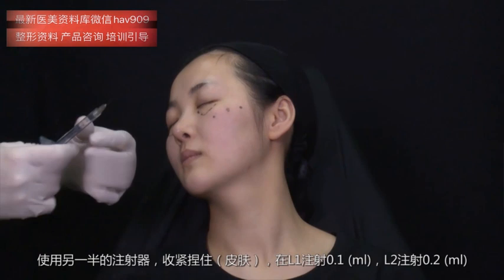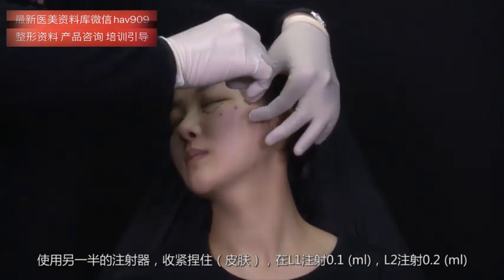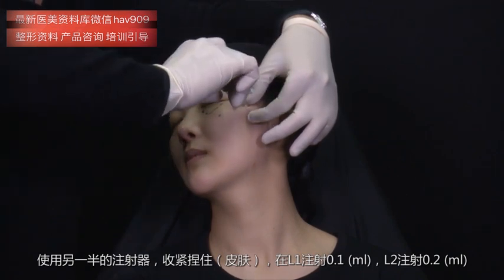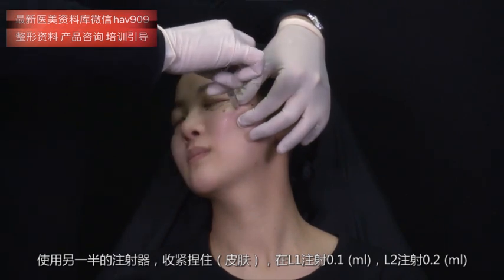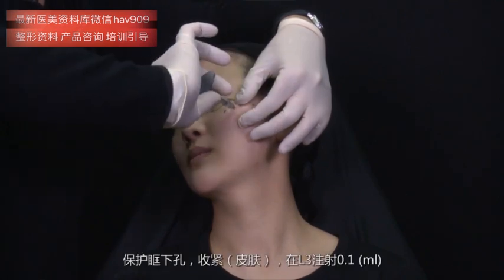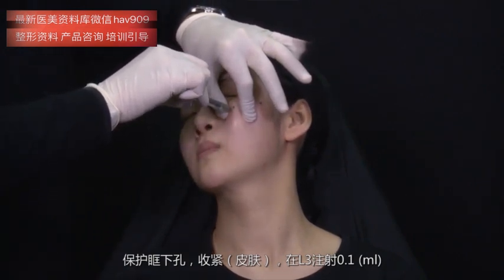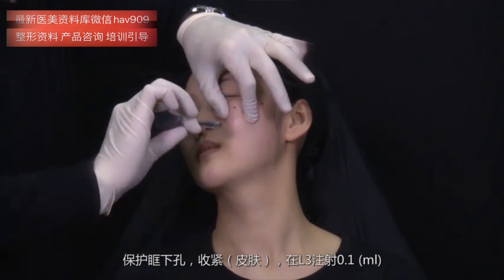So, with the other half of the syringe, we retract, we pinch, and inject 0.1 in L1, 0.2 in L2, and protect the foramen, retract, and inject 0.1 in L3.